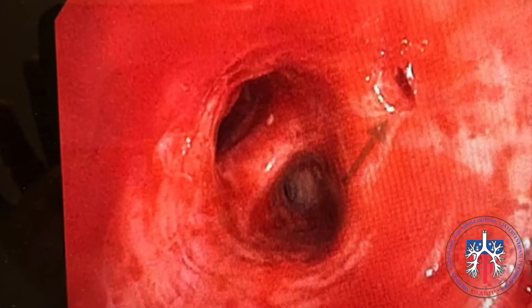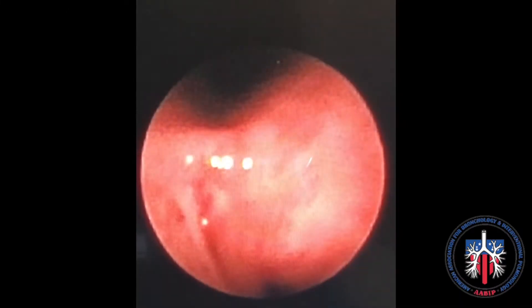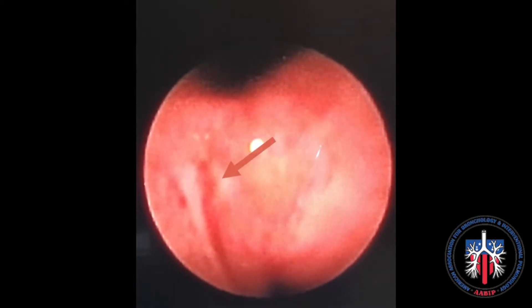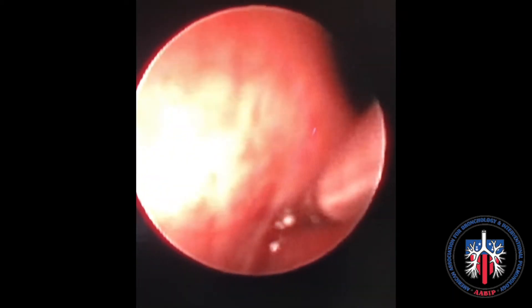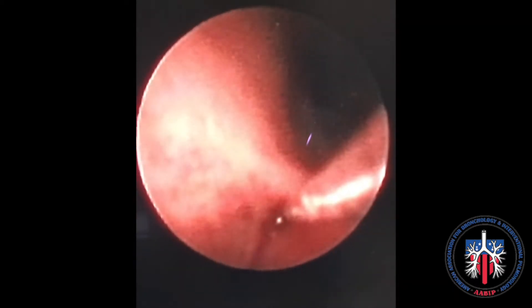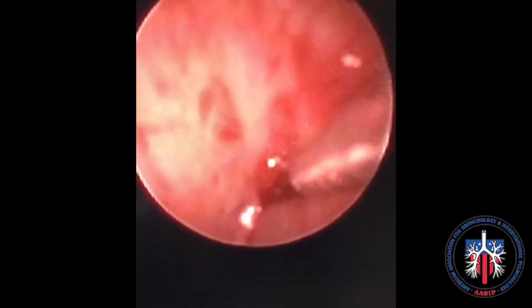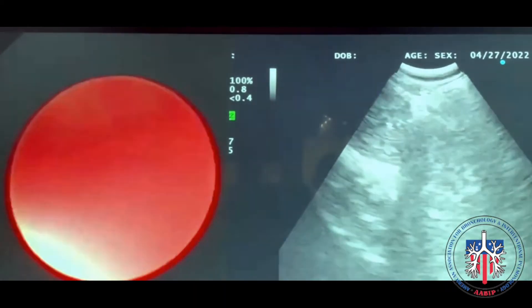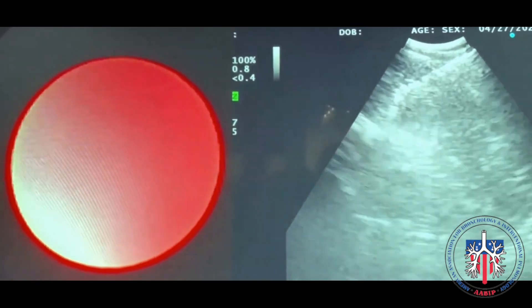The forceps is deployed through a needle puncture site as shown here. On the endobronchial ultrasound view, the forceps can be clearly seen in the open and closed position during sampling.